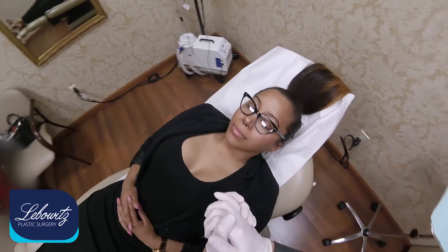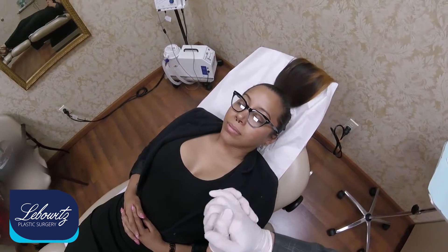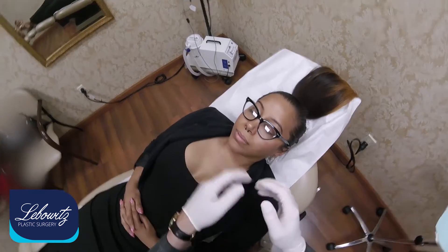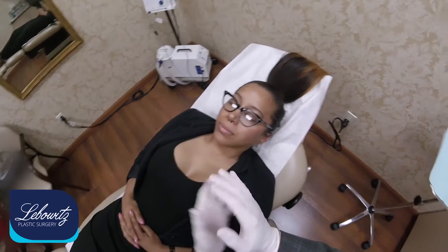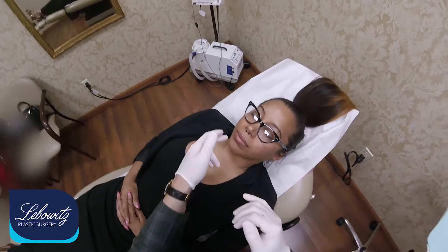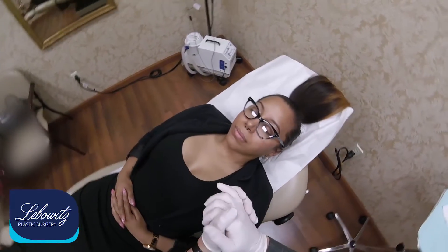With the blunt cannula, normally when you go to a doctor, a plastic surgeon, or a dermatologist, they inject repeatedly — it's called the depot or the bolus method. It's a great technique, but sometimes you can have little lumps and bumps and bruises because you actually inject five times on the upper lip, three or five times on the lower lip.